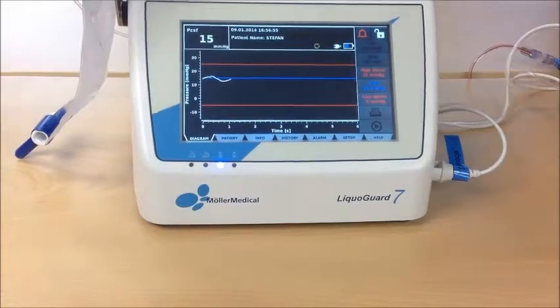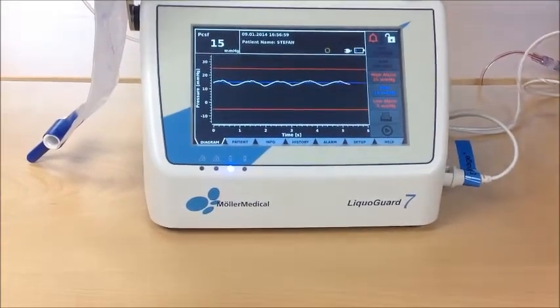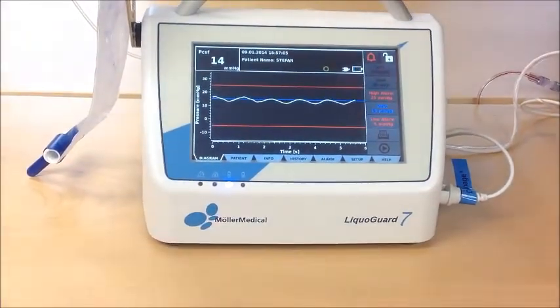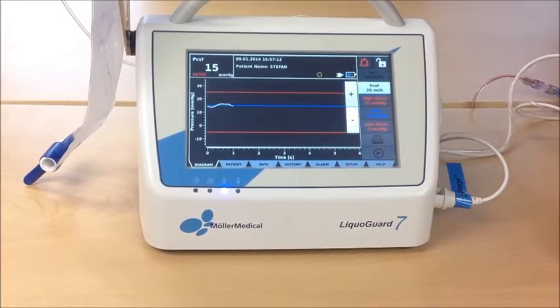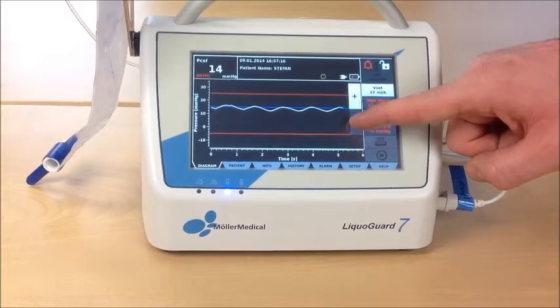When you want to do volume control drainage, you want the LifoGuard to always drain constantly, without paying attention to the patient's pressure. Therefore, we first of all reduce the speed to not overdrain the patient.